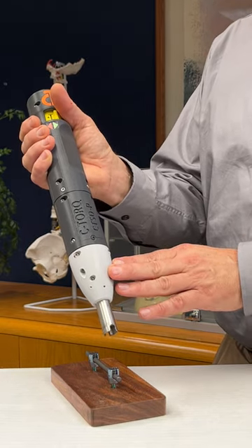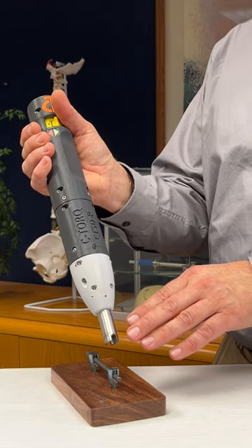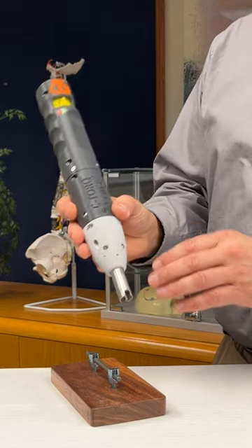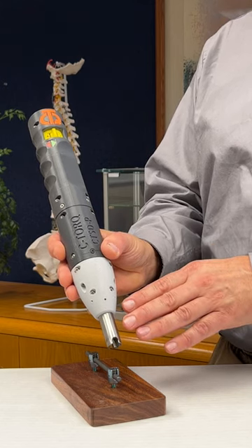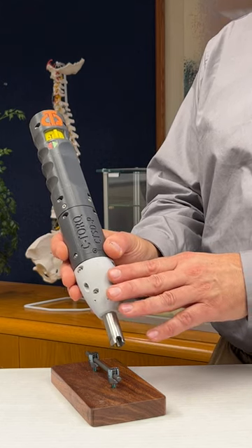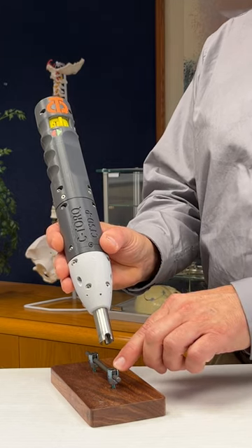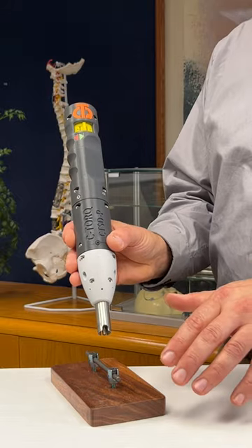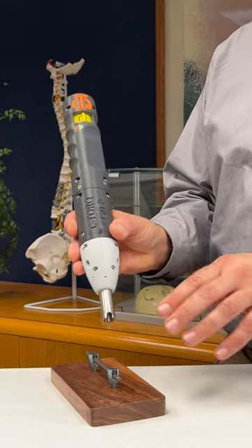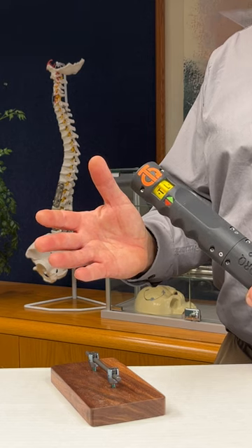The torque limiter has indicated that the set screw has now been tightened to 8 Nm. It is important to recognize that all of the forces, torques, and stresses are contained within the instrument and the pedicle screw that is being tightened. This means that all of the other implant components, the patient's spinal column, and even the surgeon's hands remain stress-free.